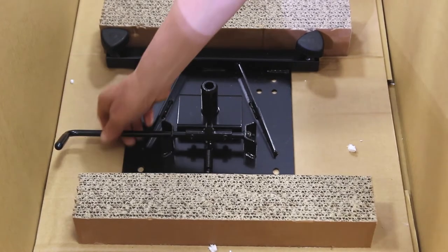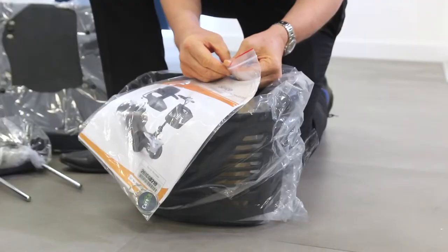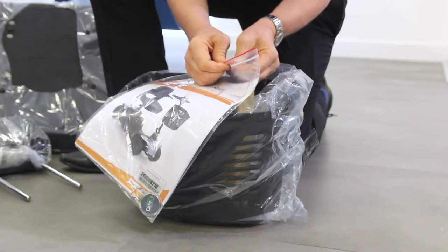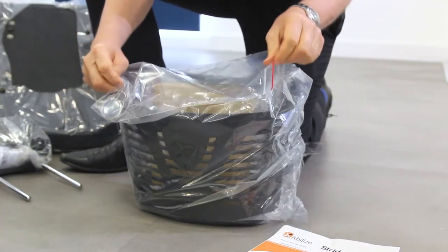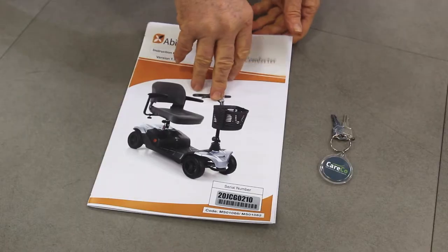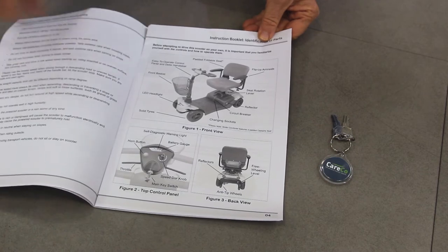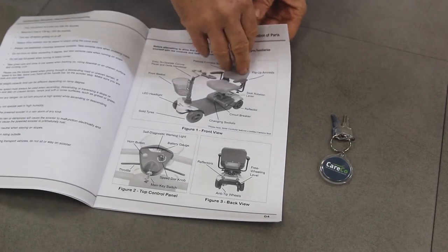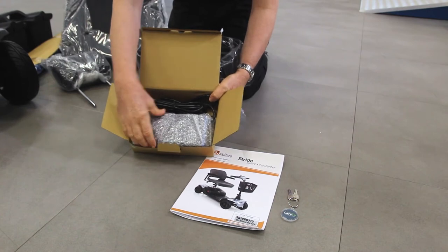The last remaining item in your box should be the seat plate with swivel control — keep this with the rest of your scooter. Sealed in a clear plastic wallet with the ignition key, you'll find the instruction manual. Please keep hold of this as it contains vital information on the assembly, basic maintenance and best use of your scooter. Packaged with your front basket you'll find the scooter's battery charger.